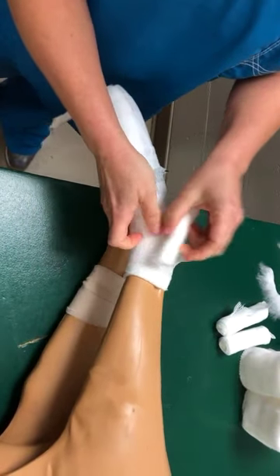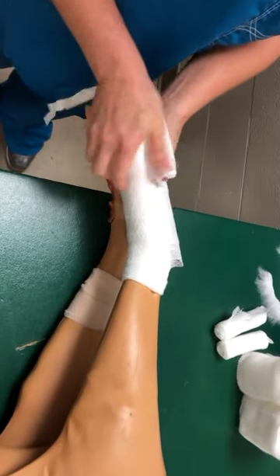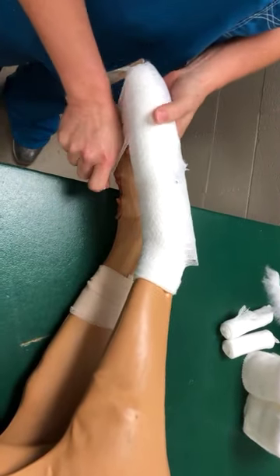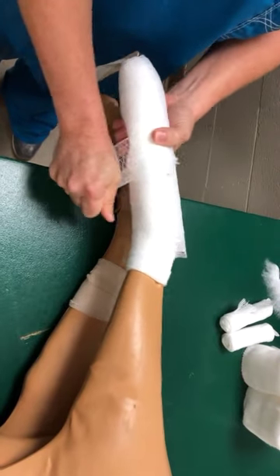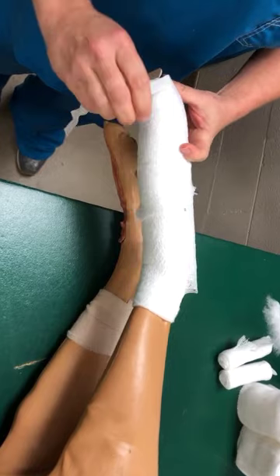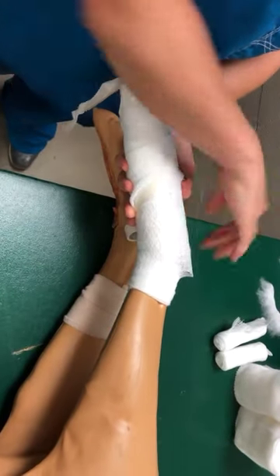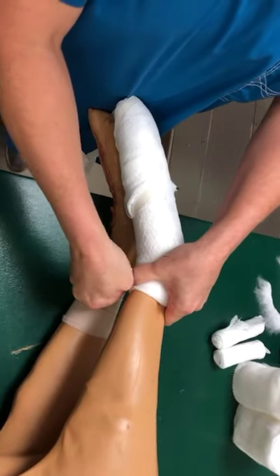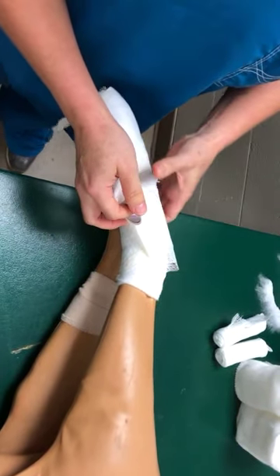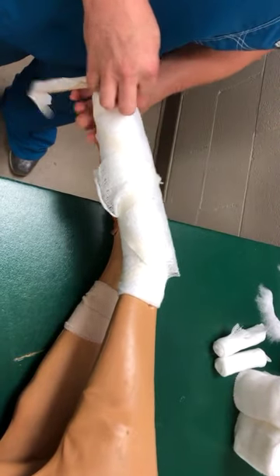On some large breed dogs such as Great Danes, they are so heavy and strong that even if we put the stretch gauze as tight as we can physically get it without causing a problem, it still creates a bit of a flip-flop effect with our splint. The only thing you can do to fix that is get a roll of small tape and wrap it around the limb at an angle — we call it the argyle wrap. We need to make sure we don't wrap completely full circumference; we want it to always go at an angle, going down and back up. It's not that pretty, but it helps hold the splint in place when they bear weight.